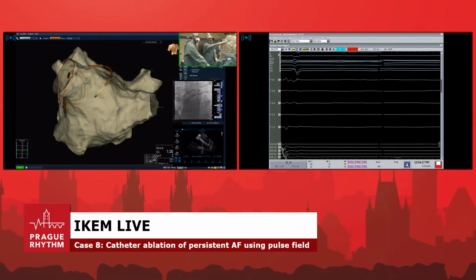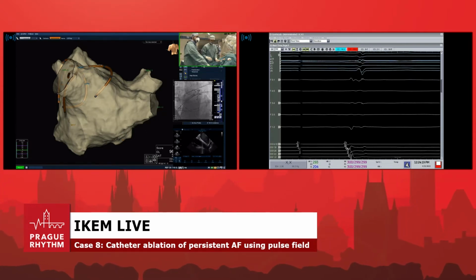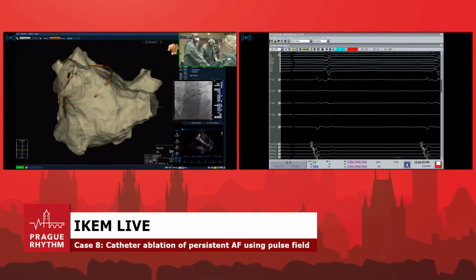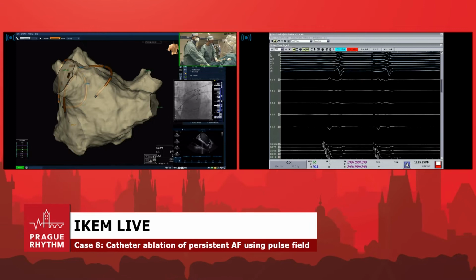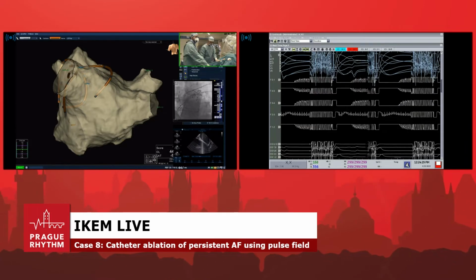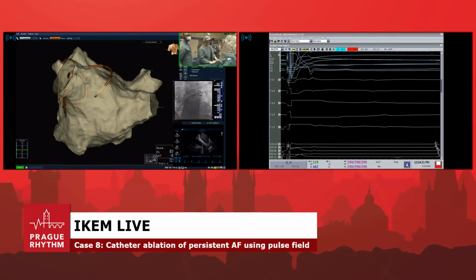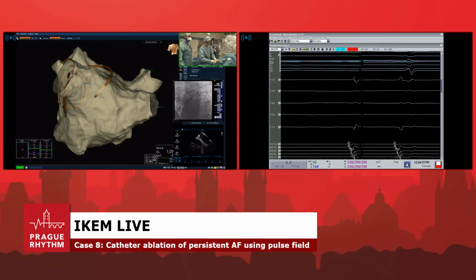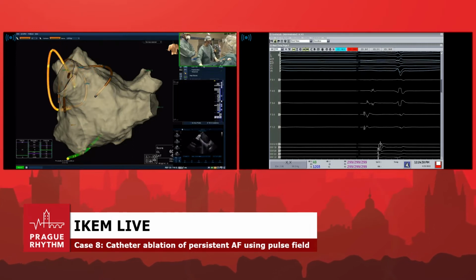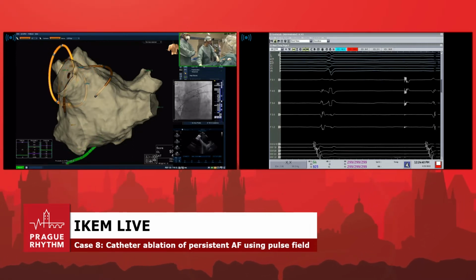See that we are hugging the inferior part of the trunk. I like this. LIPV, pulse 2 and ready. Go. Okay. Don't keep the wire. That's fine. I'm going to come back a bit. Rotate. Okay, like this. Let me adjust this.